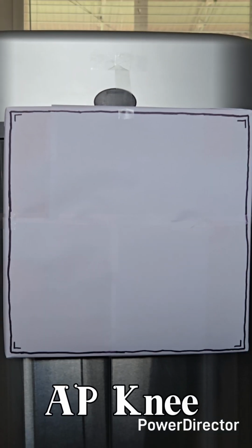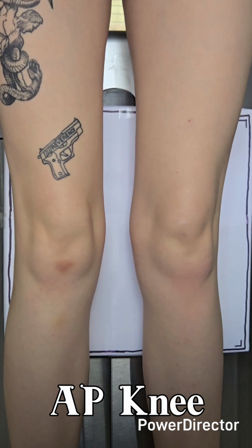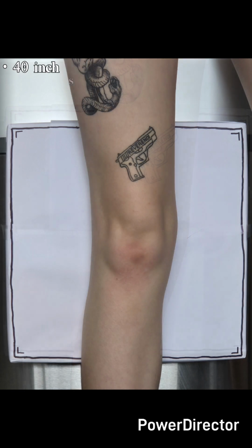Our first projection is going to be an AP knee. These can either be done bilaterally, as you can see here, or they can be done one knee at a time, like you can see here. And for these exams, the SID is always 40.